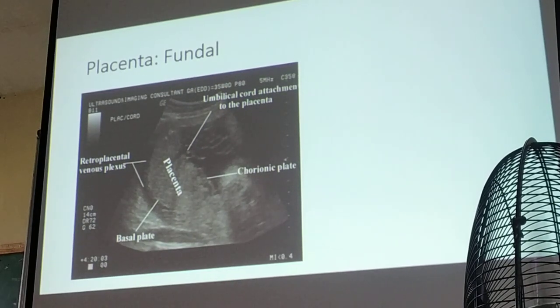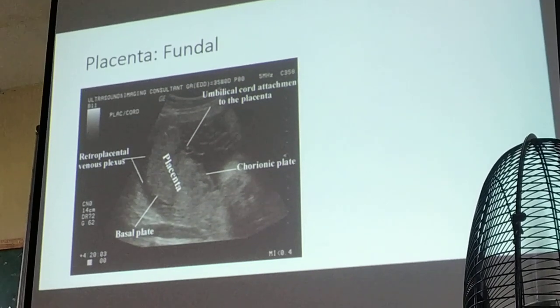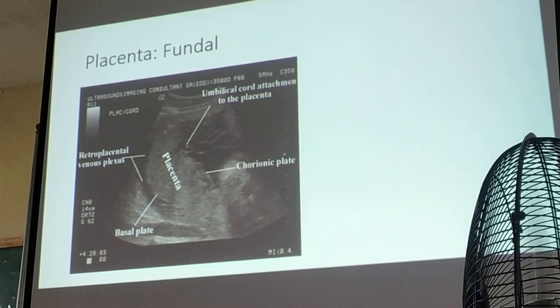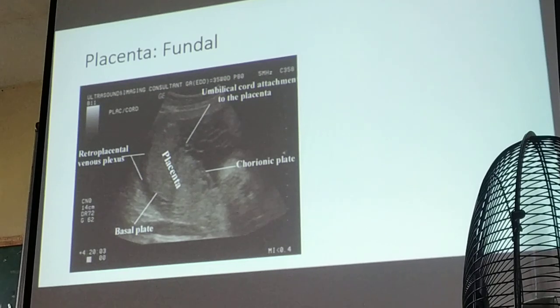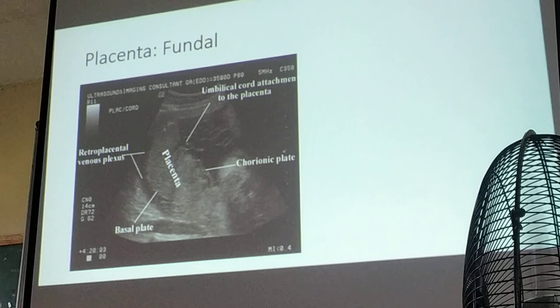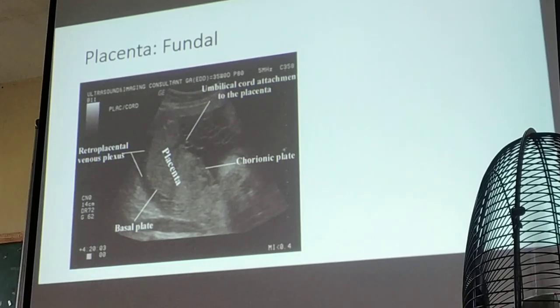Definitely, placenta localization is one of the questions. Okay? Above, it is anterior. A goes for A. Above, anterior. And then down, opposite of D, that would be P. You try to reverse, that would be posterior. And then the side, that would be fundal. Okay?